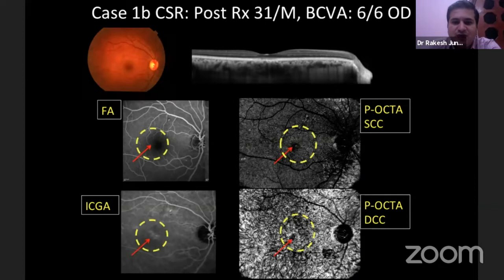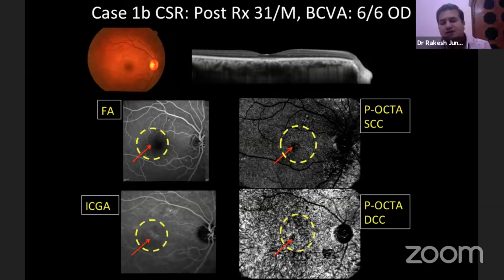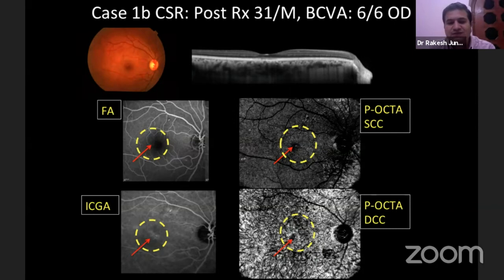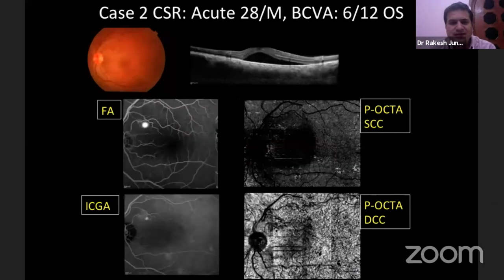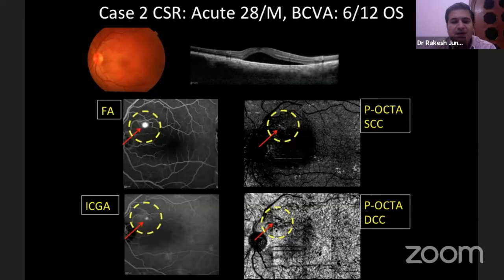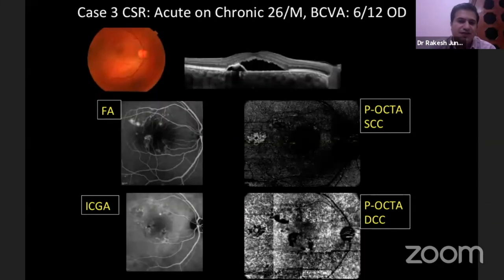The second case: we treated this patient with focal laser, and one could identify how these dilated bulb-like choriocapillaries regressed at that very same location. In the next case, one can see the blot leakage documented on the deep choriocapillaries in the form of the same round dilated bulb-like choriocapillary abnormality on the panoramic OCT angio.